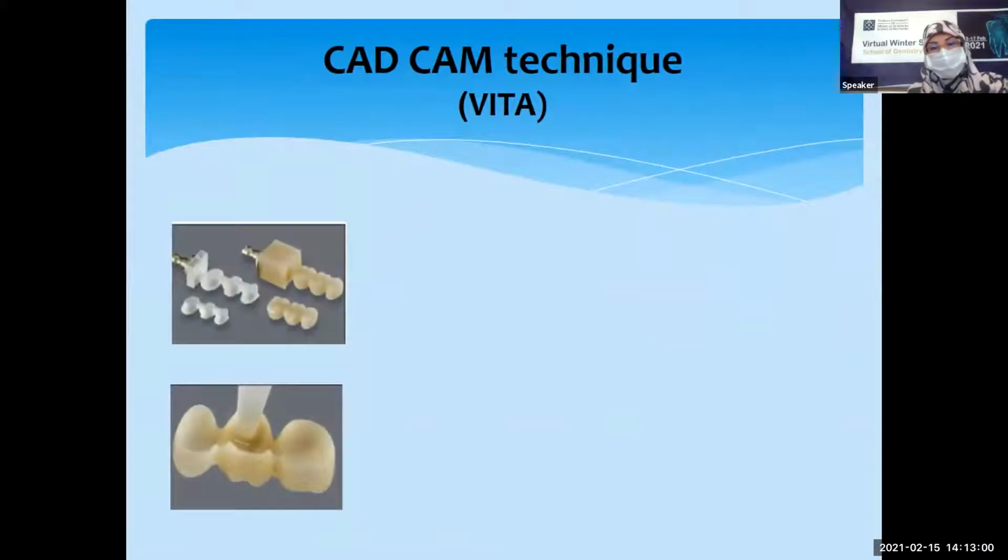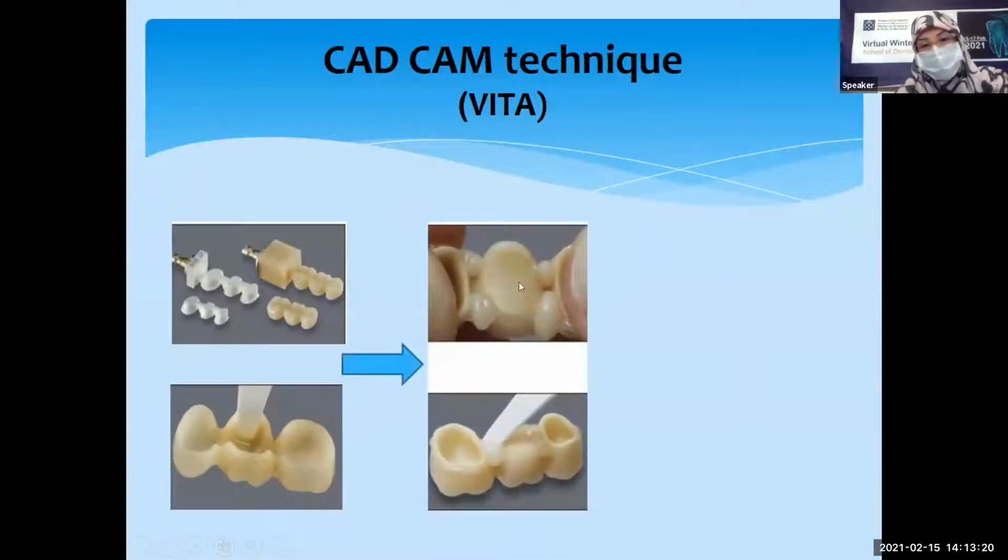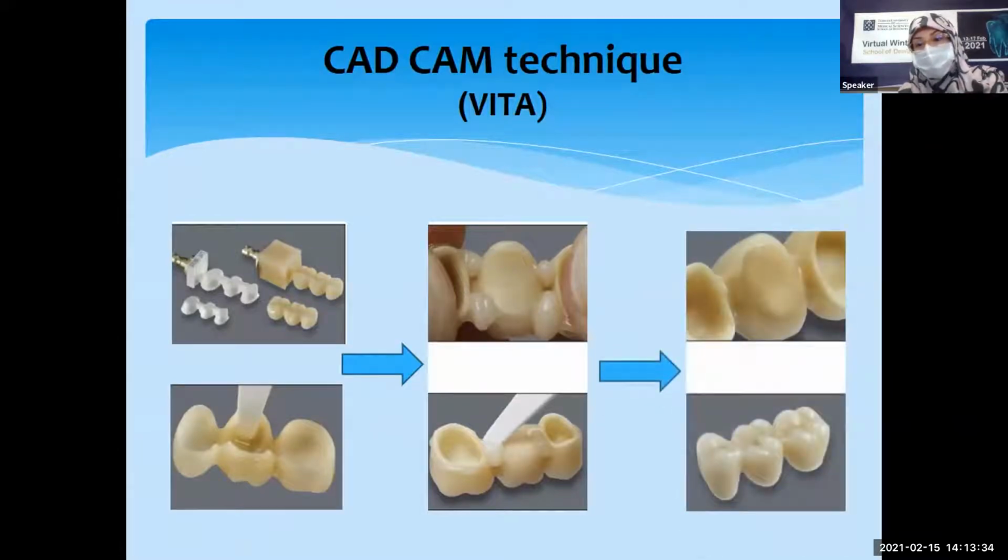There is a little difference between some systems. We have two major systems, Vita and Evocolor. In Evocolor, we have a zirconia framework and ceramic veneering. Both of them are milled and designed by CAD/CAM technology. After that, we put the zirconia core in the veneering ceramic and use an intermediate resin cement. After cleaning off the excess cement, we should cure the cement. And after that, both parts are connected together.